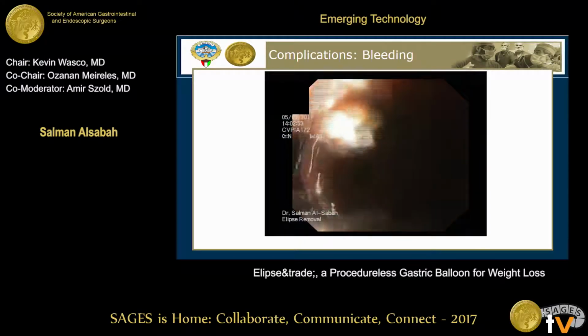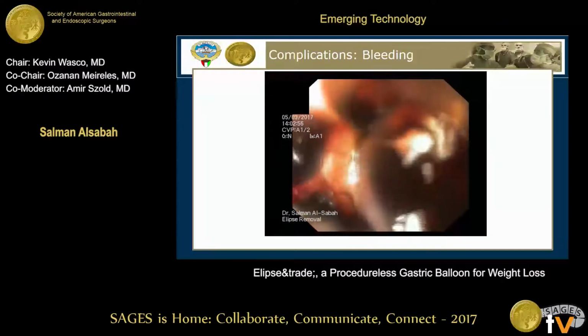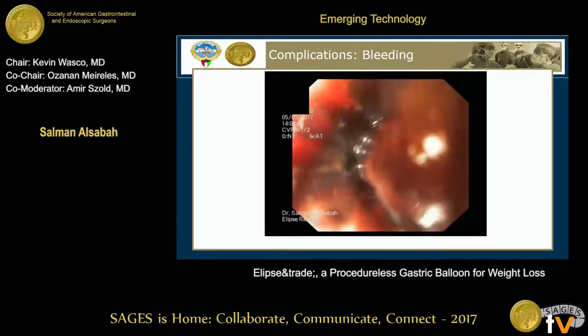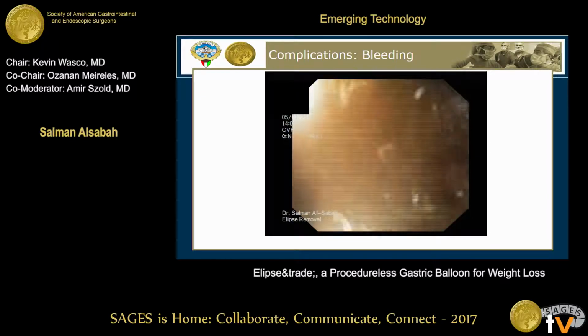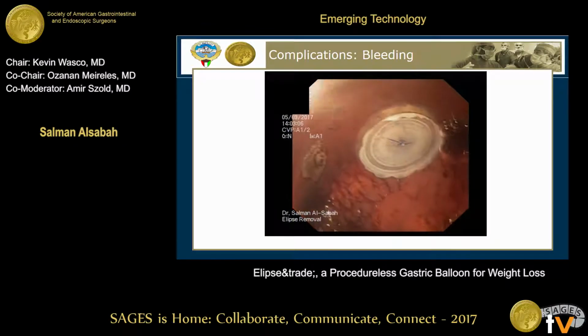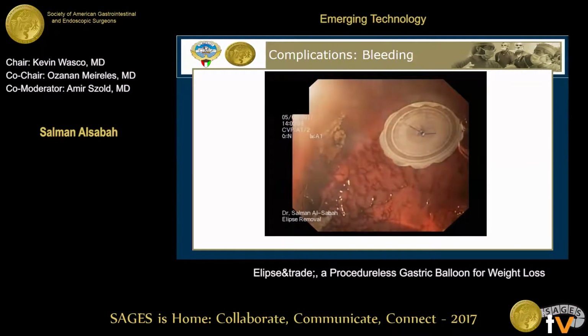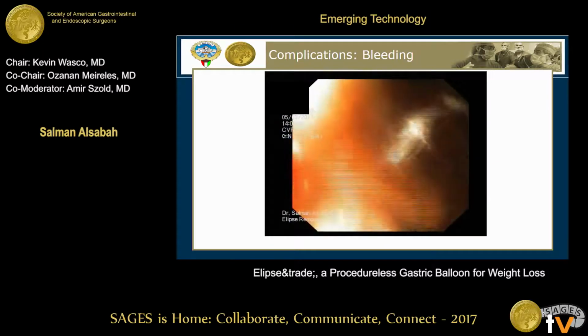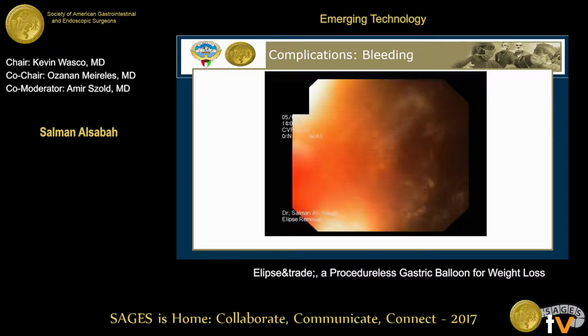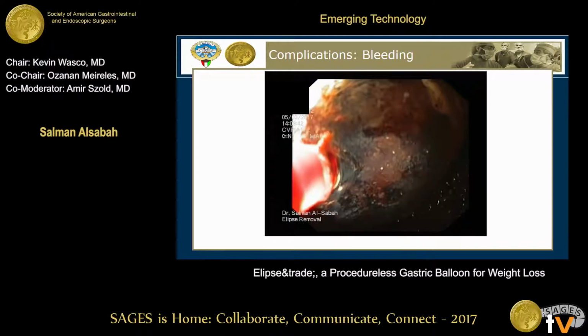That's why I think with this kind of balloon, if you have any doubt, doing an endoscopy before is wise. Any history of blood thinning medication or any of the contraindications mentioned by the company should be taken seriously. You can see the balloon here. You can see the special valve that it has. Basically, in this case, you can see there was blood in the stomach. We removed around 500 ml of blood, and then the balloon was removed.